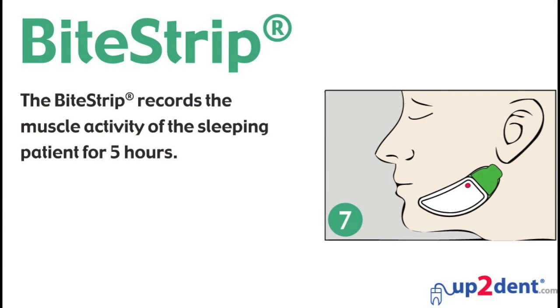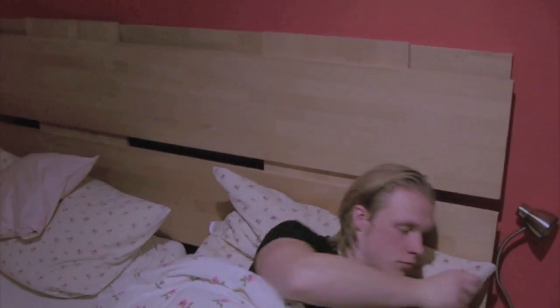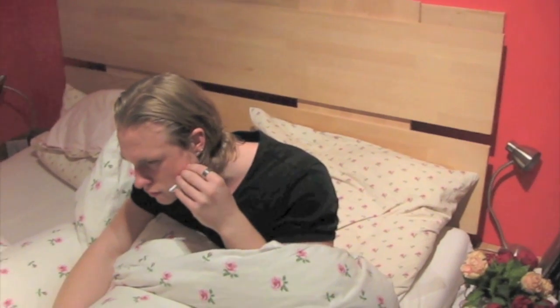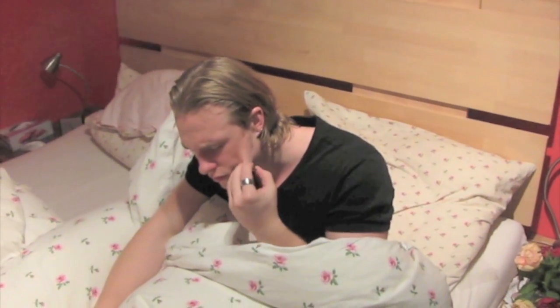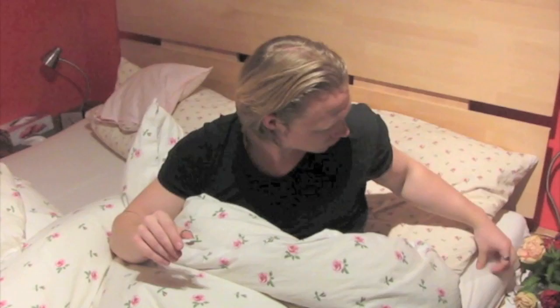The Bite Strip records the muscle activity of the sleeping patient for 5 hours. Please take the Bite Strip back to your dentist for the evaluation.